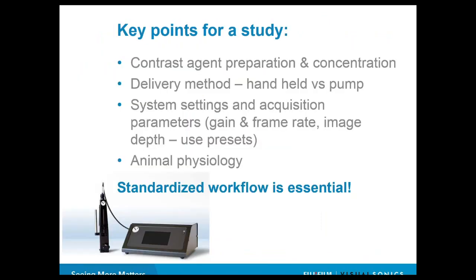As I already hinted at in the last slide, there's quite a few parameters you need to be aware of when doing contrast imaging studies. And these all will affect the data that you get, the quality of your imaging, the quality of the data that you can obtain. So for contrast imaging in general, a standardized workflow is quite essential.